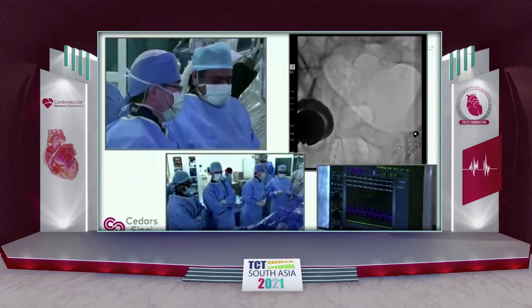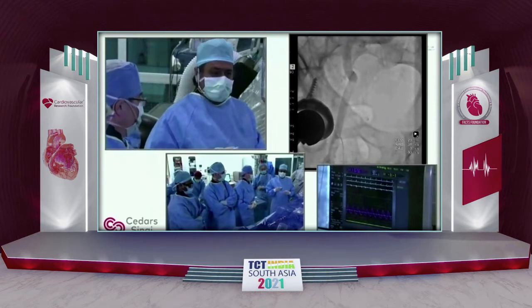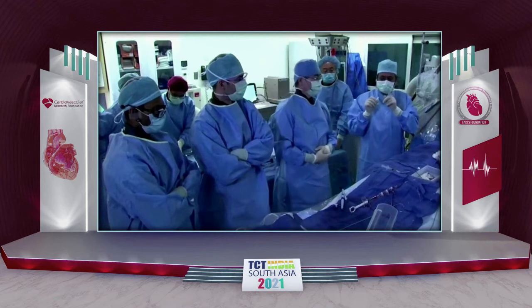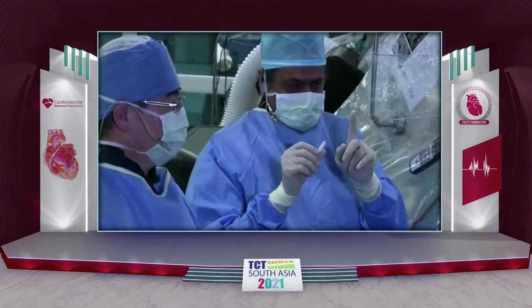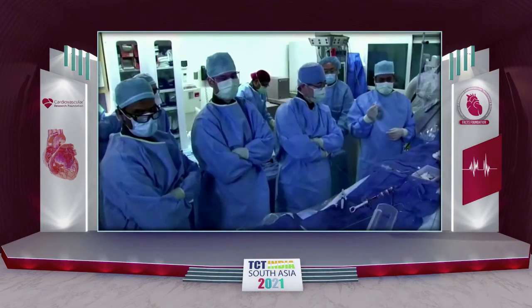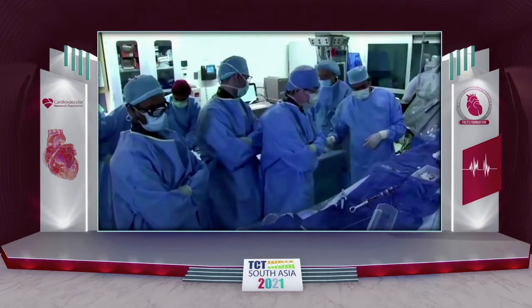Sure. So Dwayne, there are different types of micropuncture, and you are right. There is one with the inner core that is very stiff. This one is actually very soft. I don't know if you can see this or not, I'm bending it. Those of us who train fellows find these little things very meaningful because these things actually enhance the safety of the procedure.